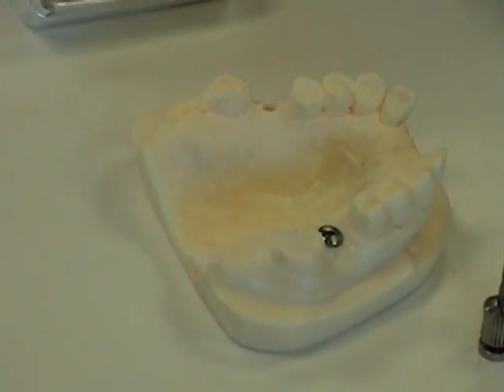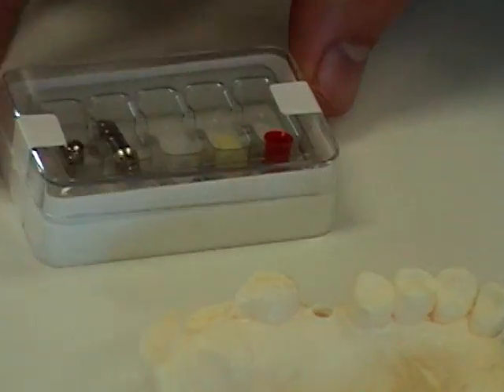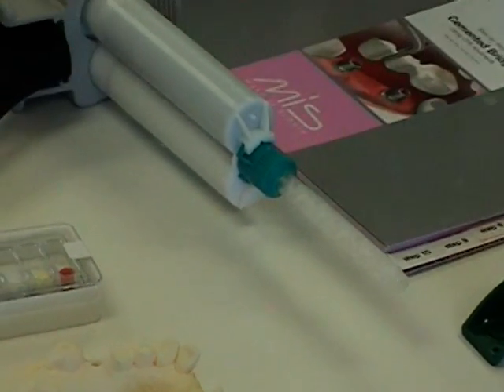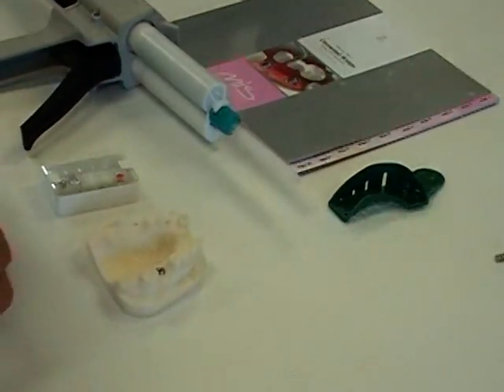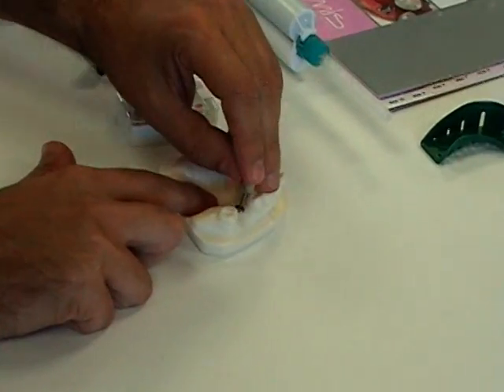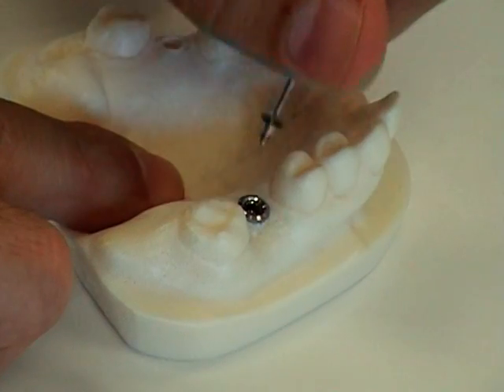In this case, since it's a single crown, we're going to use a red anti-rotational plastic. The first step in the process will be to remove the cover screw from the top of the implant. We're going to be using our .05 inch hex driver, just like the one that's in our surgical kit, to take off the cover screw.